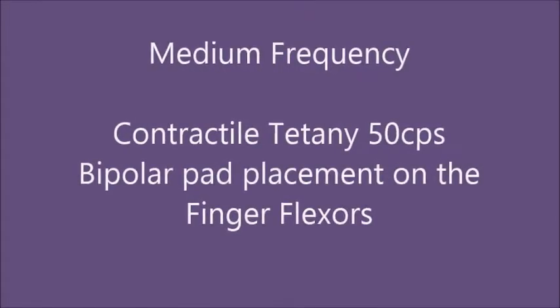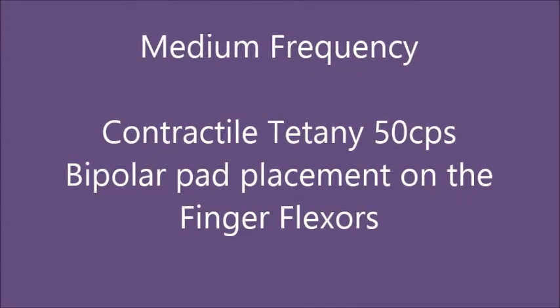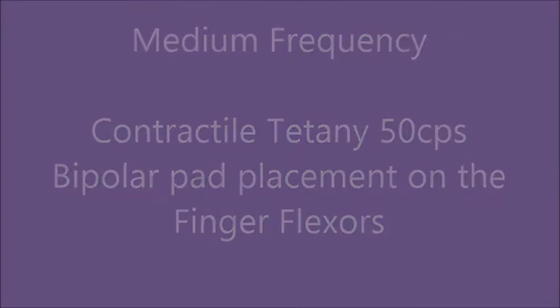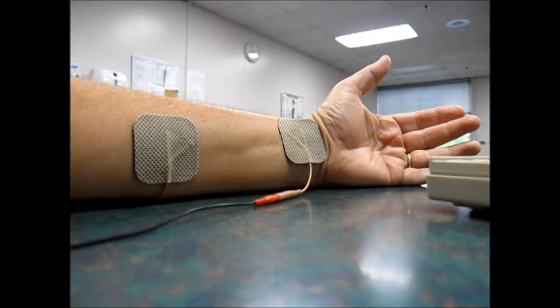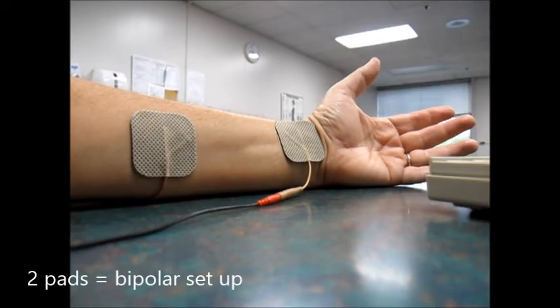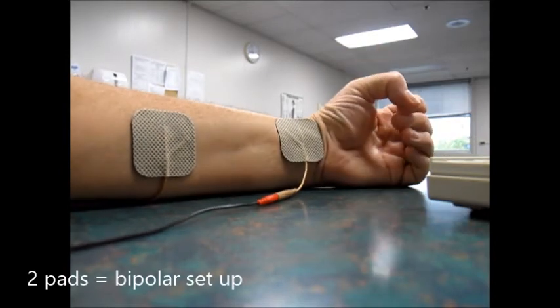Medium frequency showing contractile tetany at 50 cycles per second on finger flexors. This is a bipolar setup on a tendon to cause pincher grip on this hand.